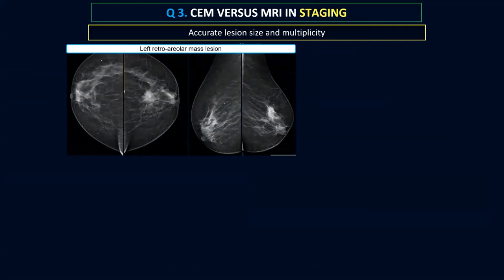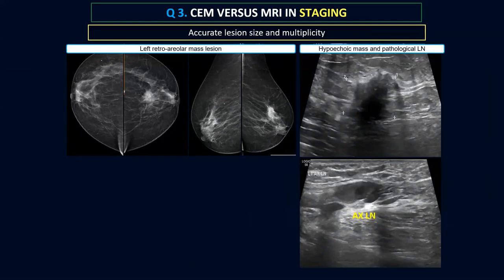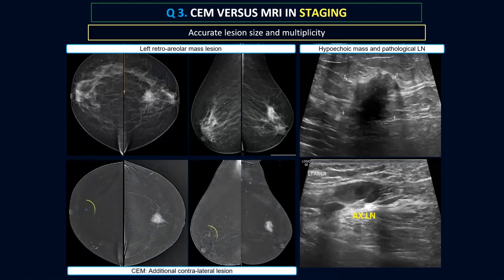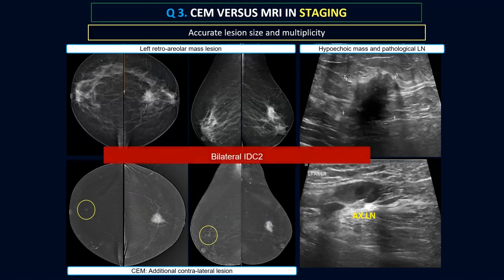Another case: a left retroareolar mass lesion with pathological axillary lymph nodes on ultrasound. We can never assess pathological nodes based on contrast mammography. On her contrast mammogram, we did not see the axillary nodes, but we saw something additional — another very tiny carcinoma present in the contralateral breast. The management changed into bilateral conservative surgery for bilateral invasive duct carcinomas.